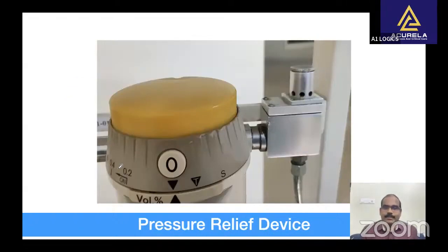Now, we look at the pressure relief valve. As the name suggests, it prevents buildup of excessive pressures upstream of the outlet check valve. This valve opens to the atmosphere and vents out gas to the atmosphere if the preset pressure is exceeded.